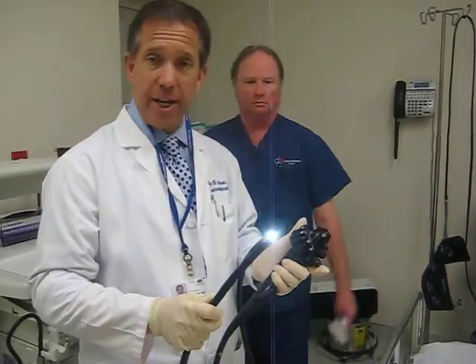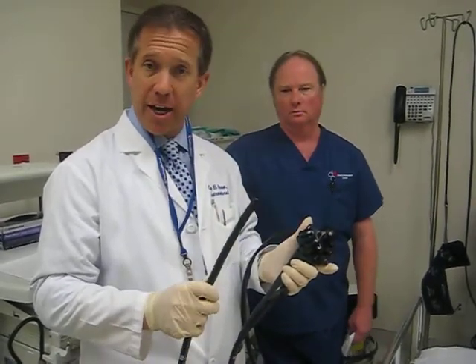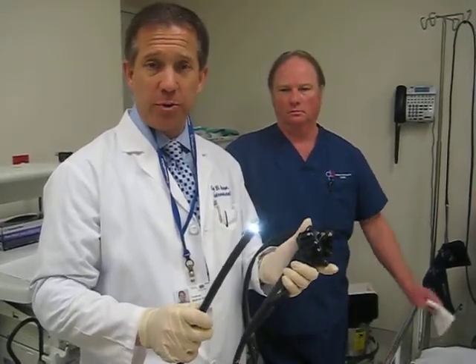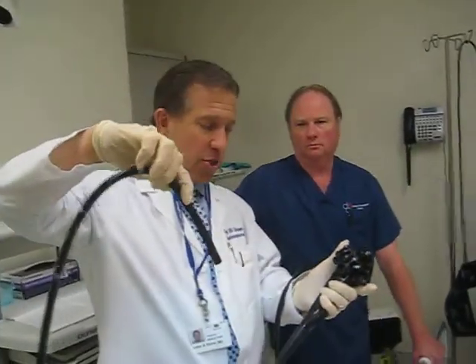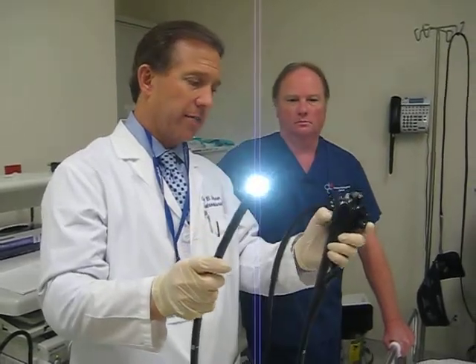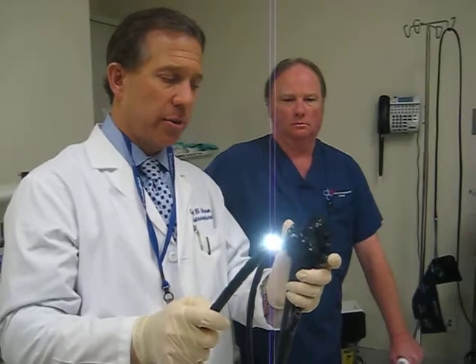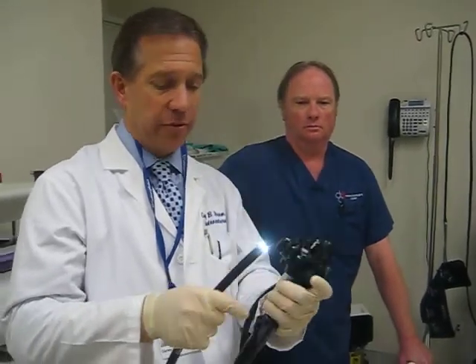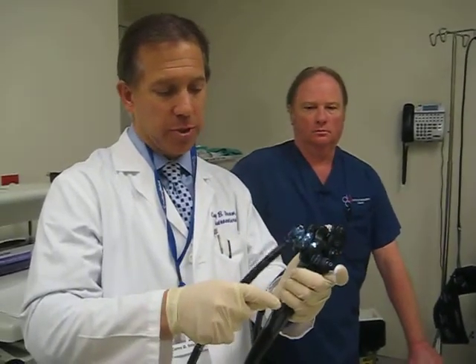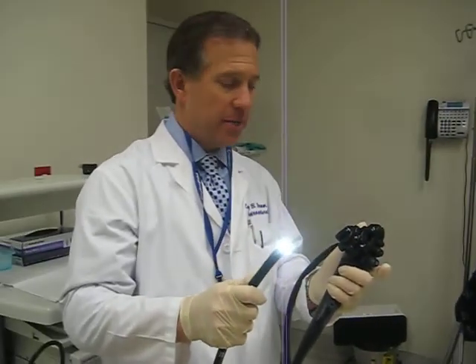We feel that everybody should have one of these done. I've had them, my colleagues have had them, so we practice what we preach. This is the colonoscope — very flexible. We can control the tip by using our left hand on the controls. We can also do therapy during the procedure because we have a channel where we can put instruments right through here and do biopsies. So there's your quick course in colonoscopy.